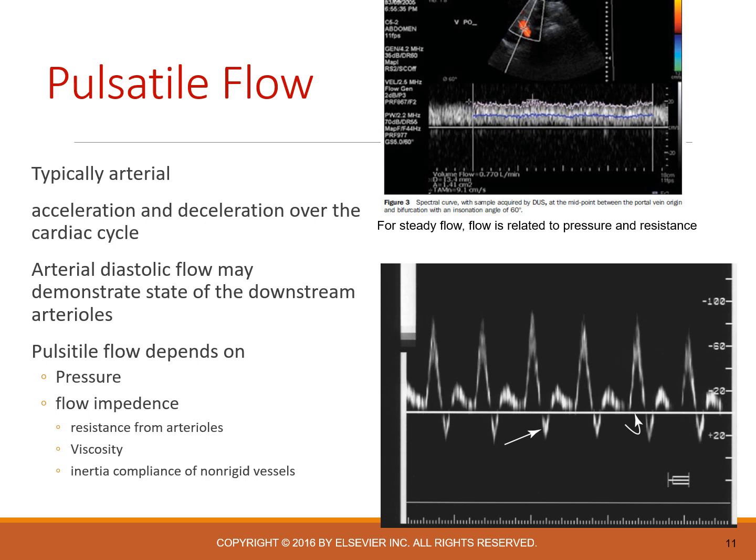So as my heart goes into systole, sorry, my heart's ugly here, it is going to be ejecting the blood from that left ventricle out into the aorta. As that happens, those cells are going to move forward very quickly. That correlates, if I look at what we have here as a spectral Doppler, to this portion of my spectral Doppler waveform where we see forward motion very quickly.